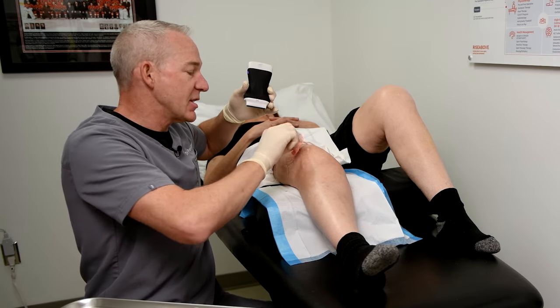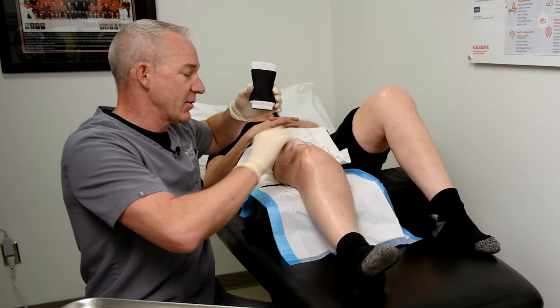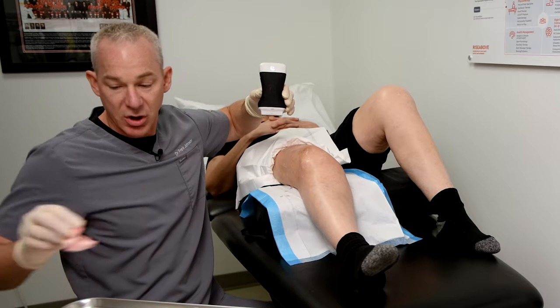I don't actually need sterile ultrasound gel because I find the skin disinfectant does a great job of conducting the ultrasound signal, as long as you don't get too much bubbling.